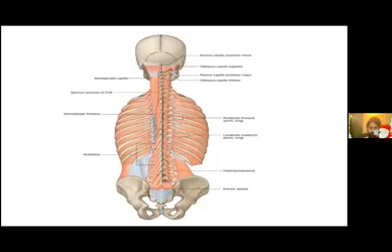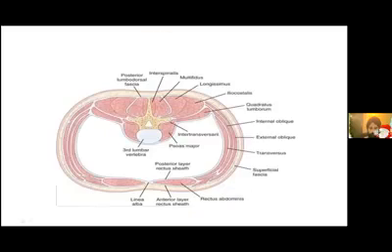And these are the intrinsic muscles, deeper to the extrinsic muscles, and which are closely related to the skeleton. And they comprise, basically at this level, multifidus, semispinalis thoracis, and so on. If you see these muscles at a horizontal distance, then in the transverse view we can see that the longissimus, the iliocostalis, and the interspinalis are just superficial to the transverse process.